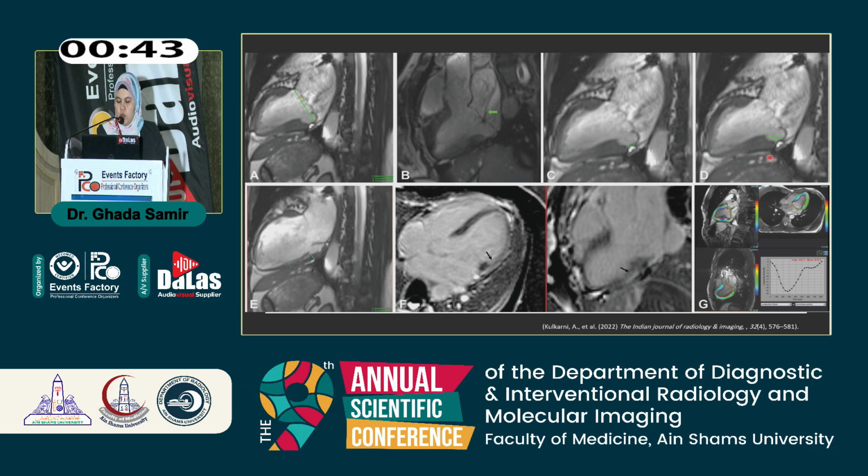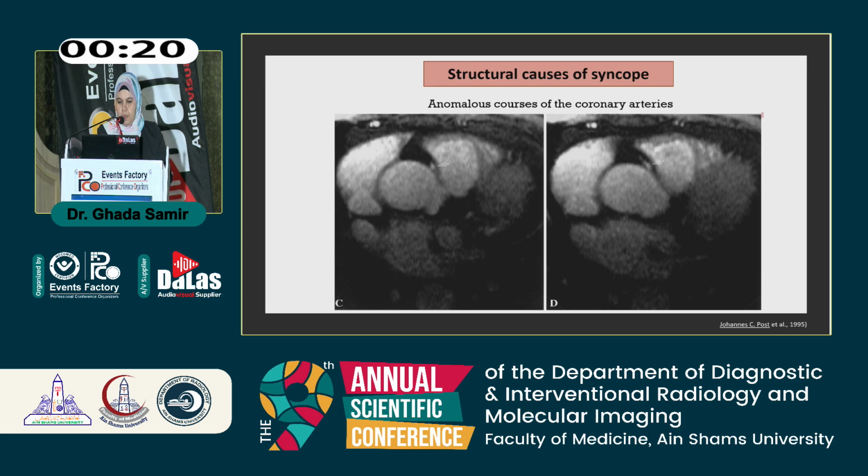You can measure the curling or distance between the basal wall, how much the myocardium is curling. Also, here we can measure the basal to LV thickness ratio, the myocardial fibrosis, and also the myocardial strain, which is dropped or decreased in cases of arrhythmic mitral valve prolapse.